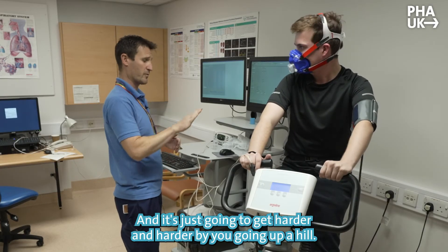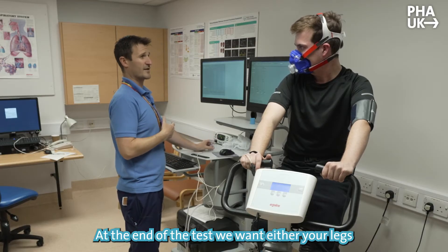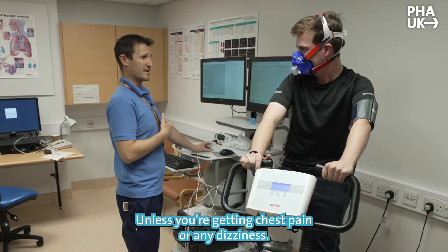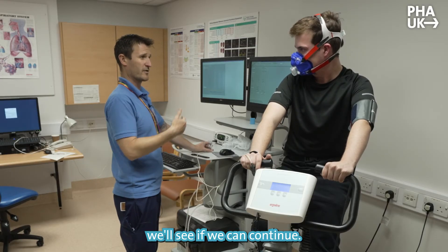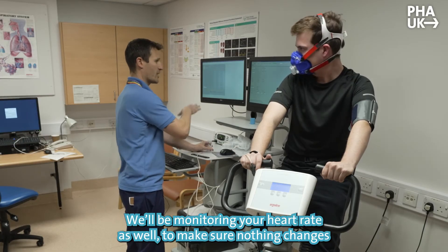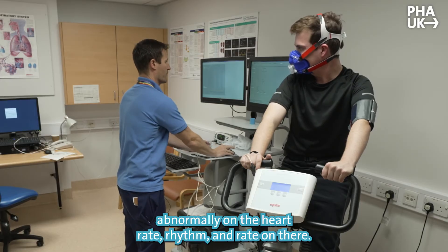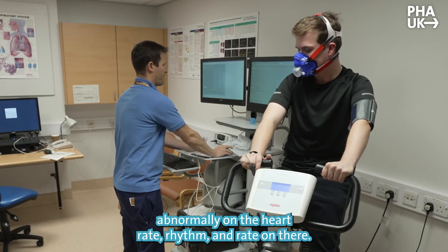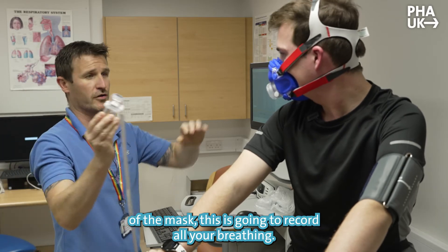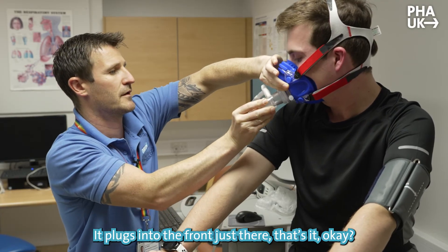At the end of the test you want either your legs or your breathing to be maximal. Unless you get any chest pain or dizziness — if you do, tap on the bars and I'll ask you a couple of questions. We'll see if we can continue; if not, we'll stop the test. We'll be monitoring your heart rate and rhythm throughout. This is going to plug into the front of the mask and record all your breathing.